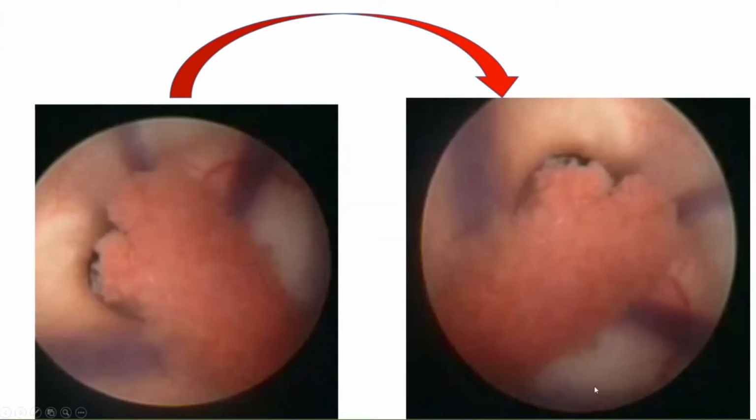Hopefully, you can all see my mouse. If this is the septum or the midline, then this has to be the septal vein. This will be the fornix. The caudate will be here, and we'll talk about the venous structures in just a bit. So the reason why the same image flipped from here to here is because you reoriented and made sure that your flexible endoscope was in a neutral position. So that's a really important point to keep in mind.